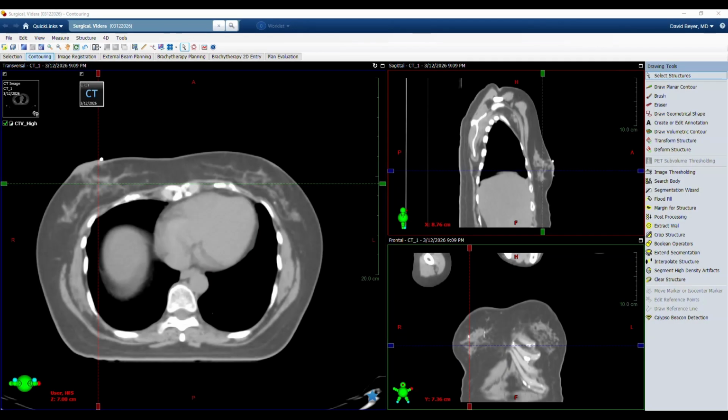I want to share with you some of my frustration in trying to contour the tumor bed in the breast. Everything else we do in radiation oncology, we can be very precise, and this, I think, involves a lot of estimation and guesswork, which is really frustrating and something that I think we need to do better going forward.